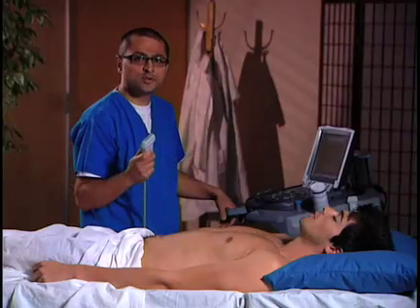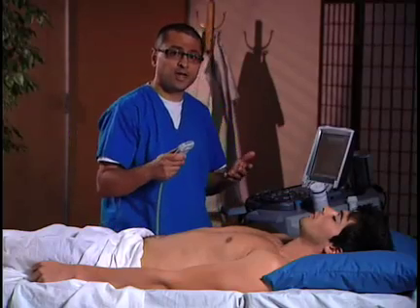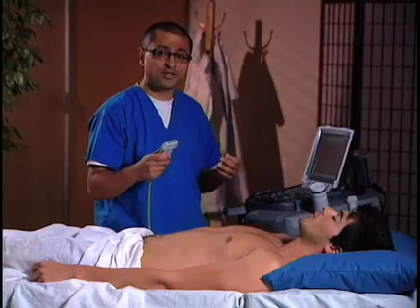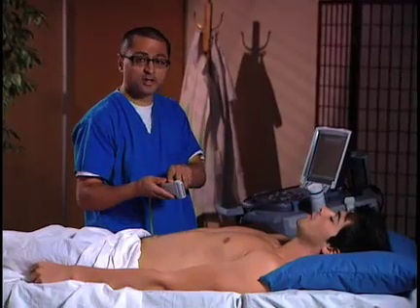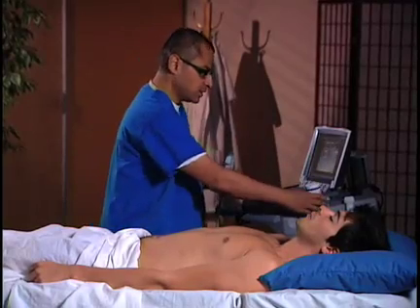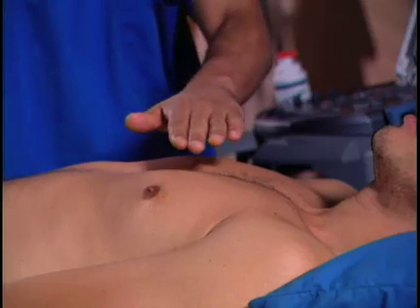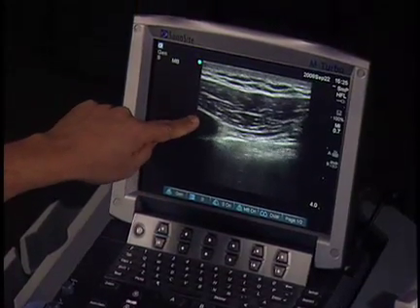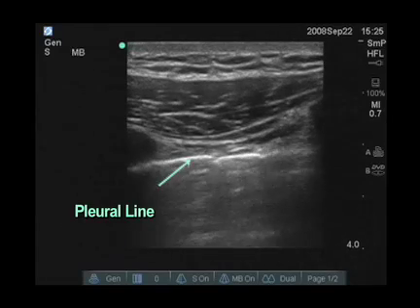If you have time, you want to use your linear array transducer. This transducer does high frequency imaging and allows you to do much better imaging of superficial structures, so we're going to get much better quality, high resolution pictures of the pleural line. I'm going to scan sagittally at the highest point in the chest in about the mid-clavicular line. To the left of the screen is a rib here and we see another rib here, and in between the two we see the pleural line.